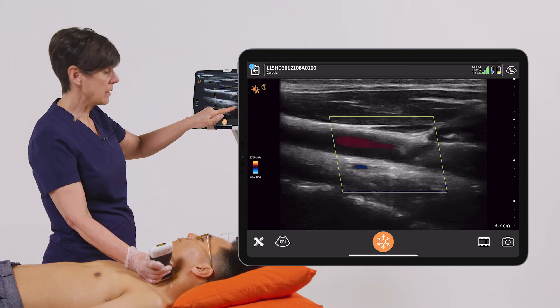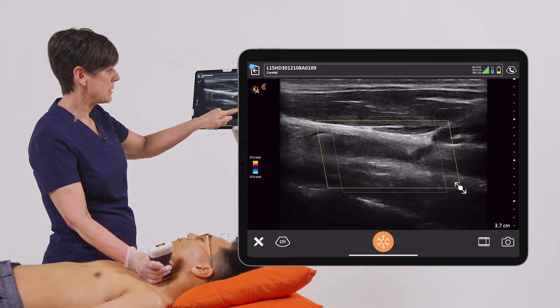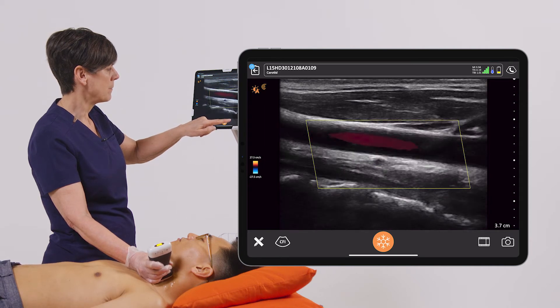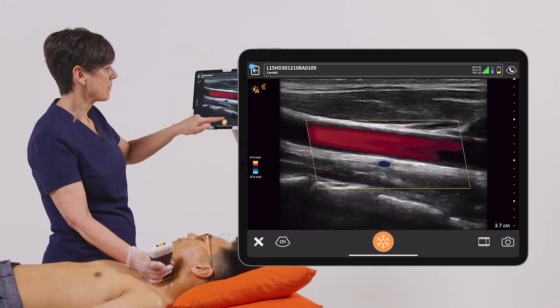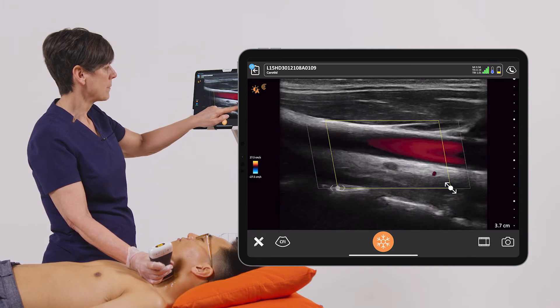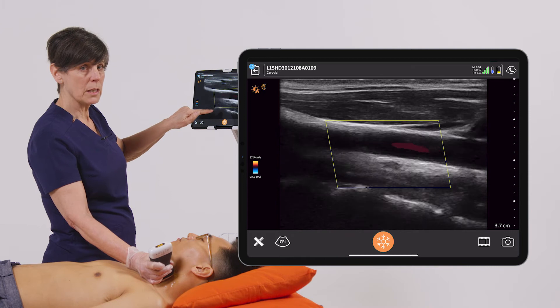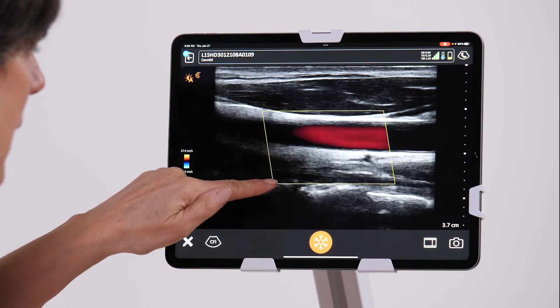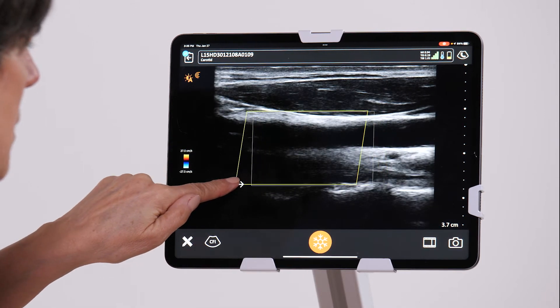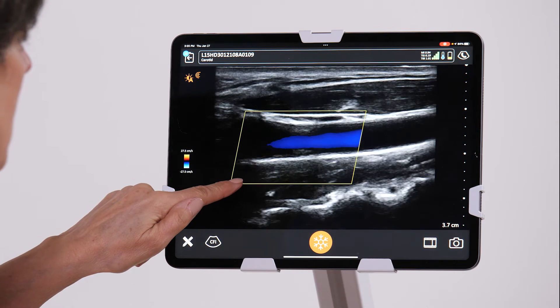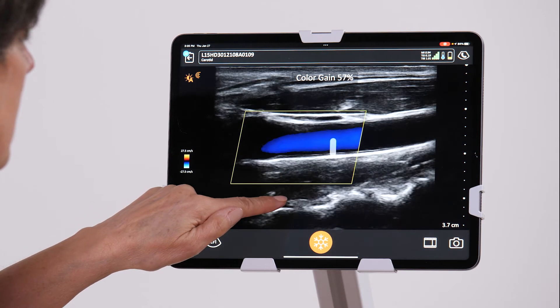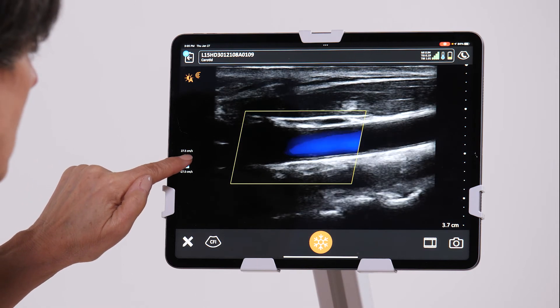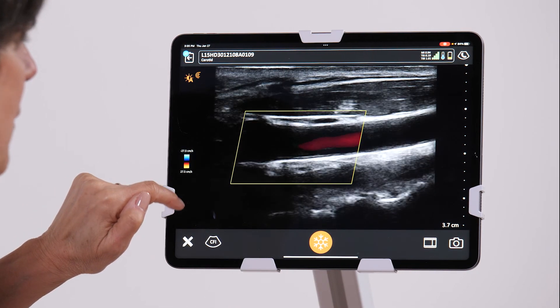I can increase the size of the color box by tapping on the lower right and dragging to a desired size, and I can also steer the color box in the other direction if I feel that the blood flow is at a different angle. So I'm going to drag to the bottom left, steer the color box in the opposite direction, and change the direction of blood flow by tapping on the spectrum. And there we have our Color Doppler.